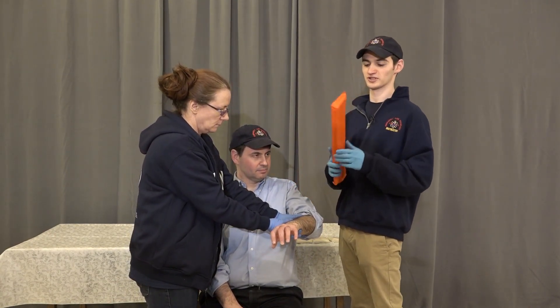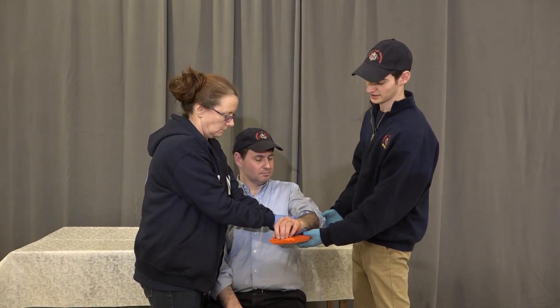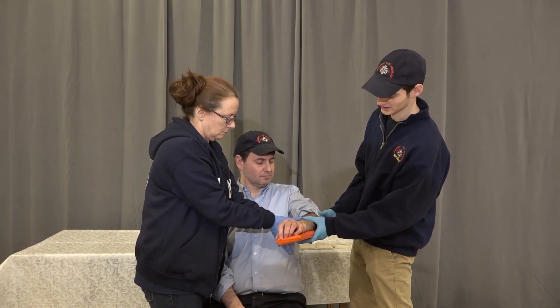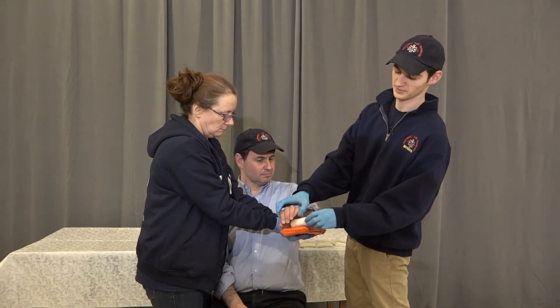We're going to take our padded board splint. We have the hard side and the soft side. The soft side is going to be in contact with the patient's skin. We're going to have my partner go ahead and hold that in place. We're going to take a piece of roller gauze to hold the hand in the position of function.